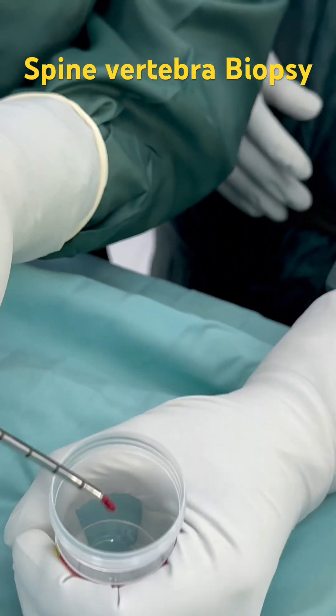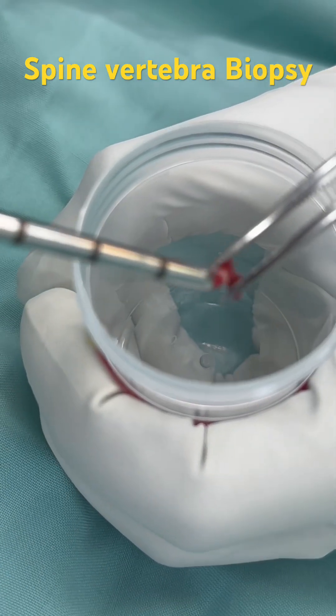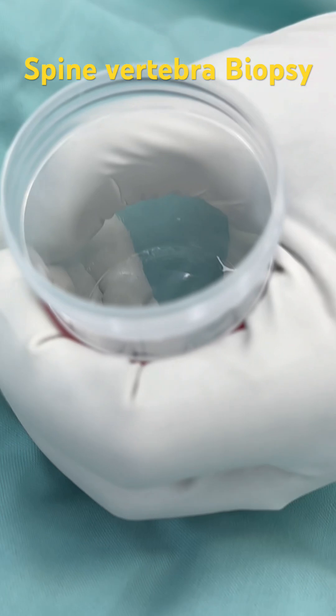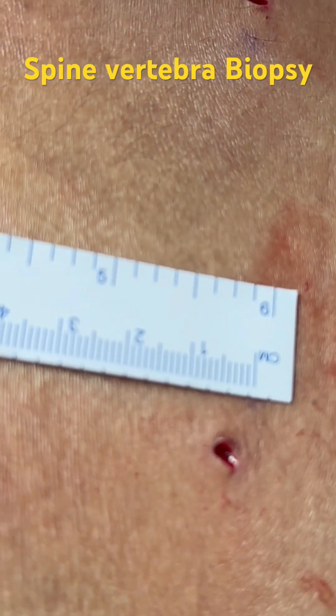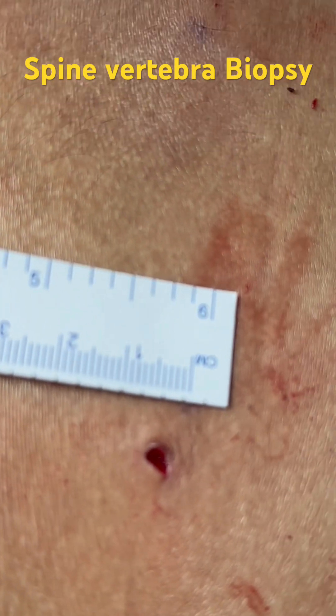You can see a big bony piece coming out here — this is the bony tissue obtained through a very small incision of less than two to three millimeters.